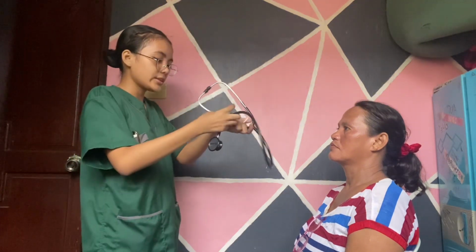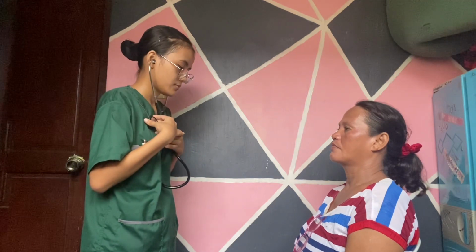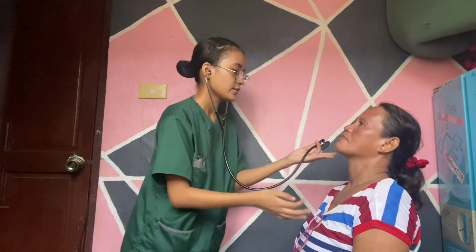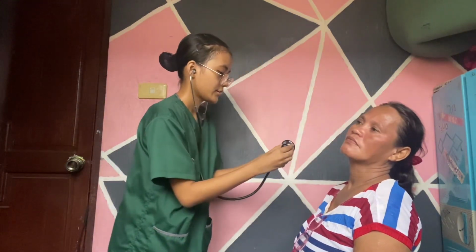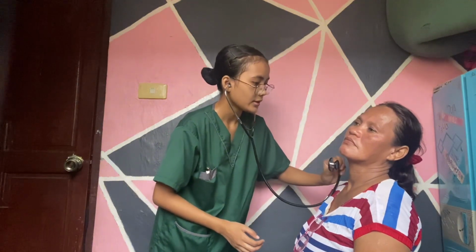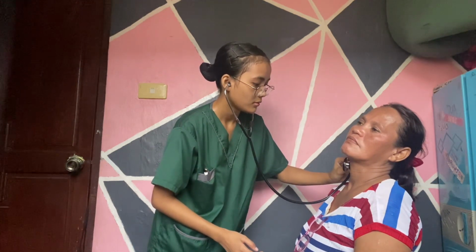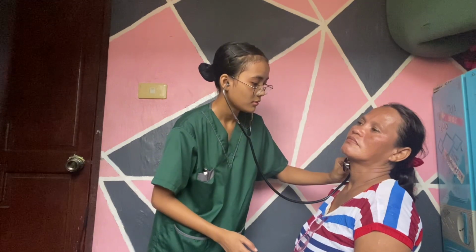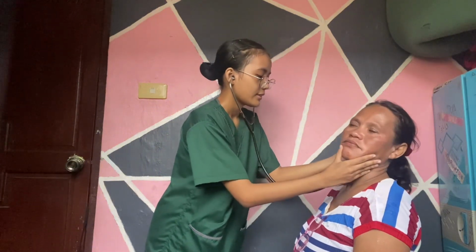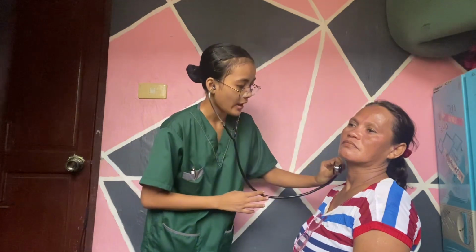So I will be using the bell of my stethoscope. So tilt your head and here. So first is the angle of the jaw. Inhale, exhale, hold. Next is the mid-cervical area here.